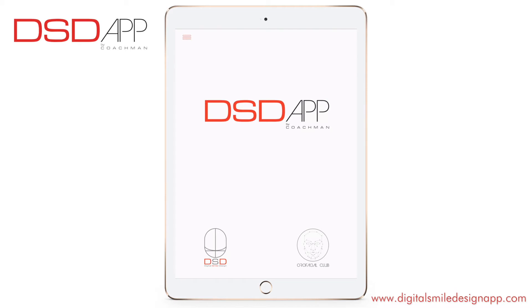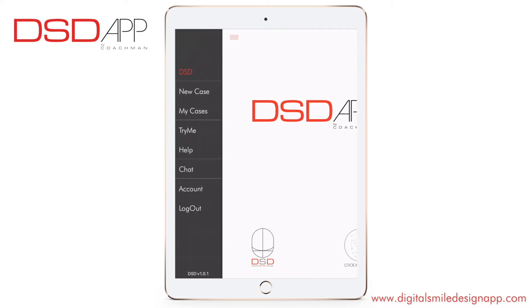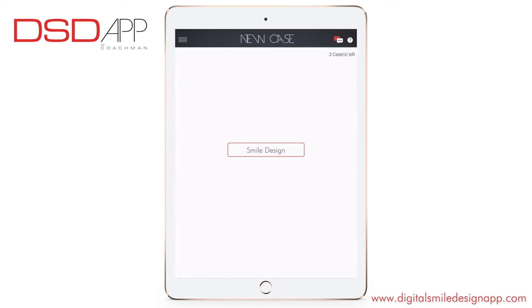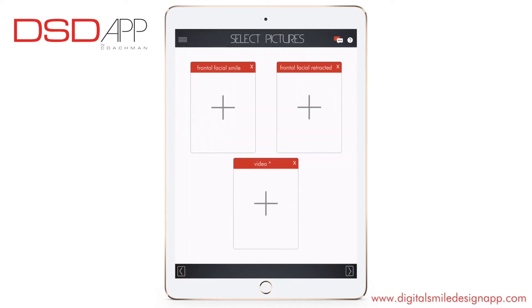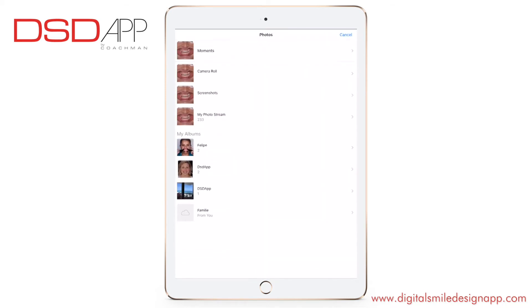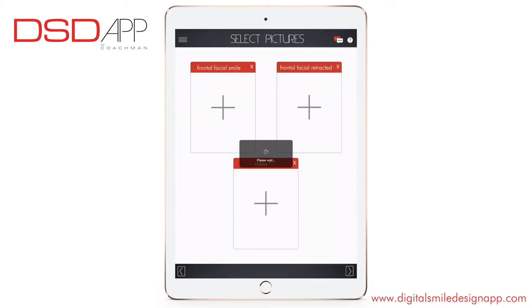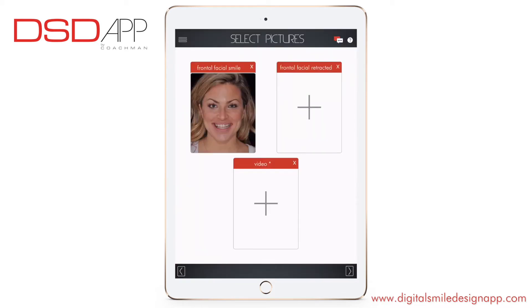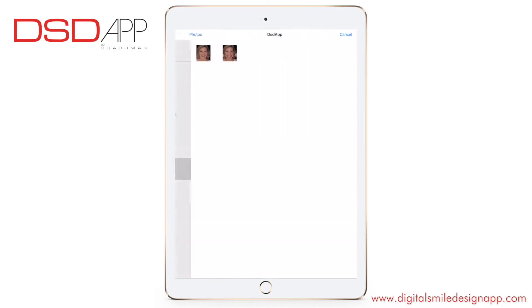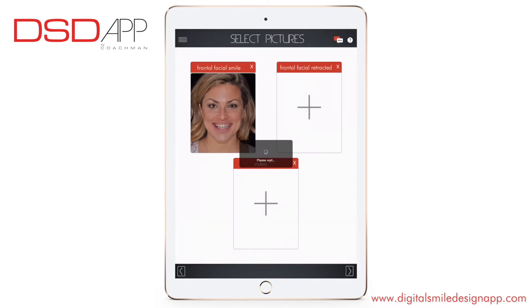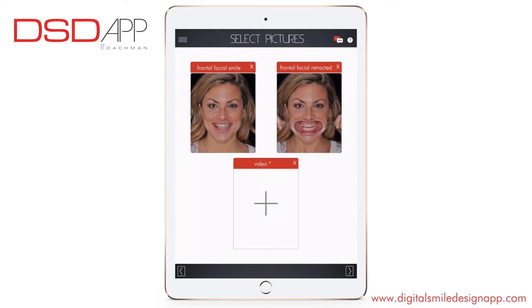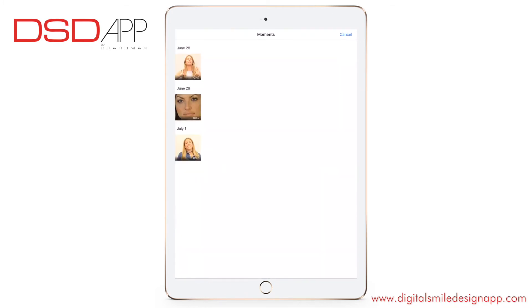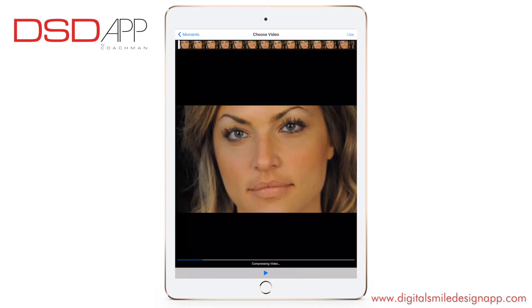Top left menu bar, new case, smile design. You can select pictures or take pictures of your patient. For the smile design we need frontal facial smile, frontal facial retracted, and a video interview of your patient. It's not mandatory.